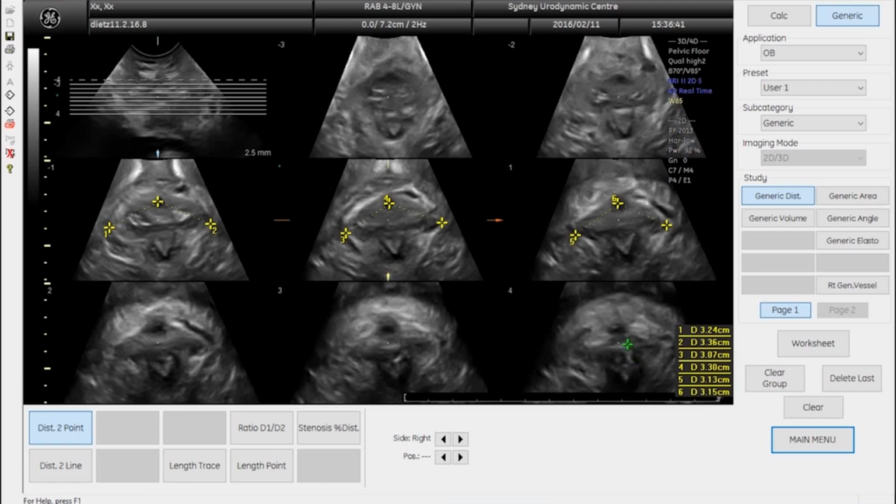Another thing to point out here is that quite often in women with avulsion you'll see abnormal vessels, abnormal veins, and that dark spot here and then curving along the pelvic side wall over here, that's a substantial vein that you can see through most of those slices. It's actually often even more impressive than that.